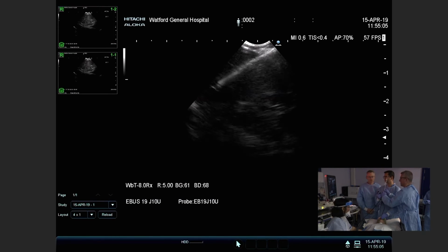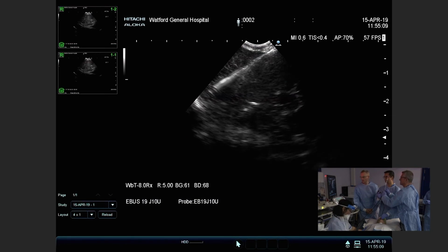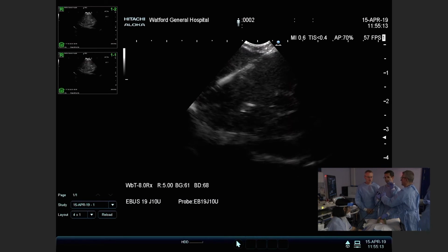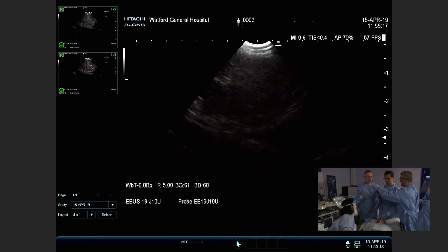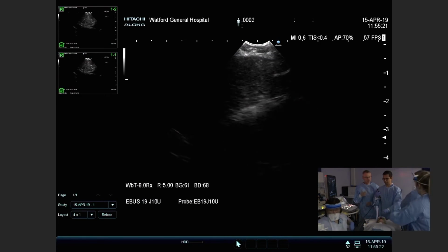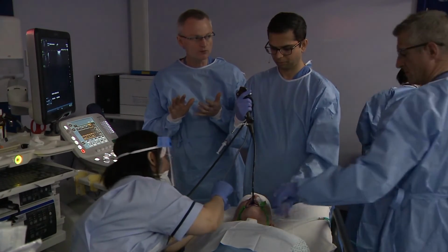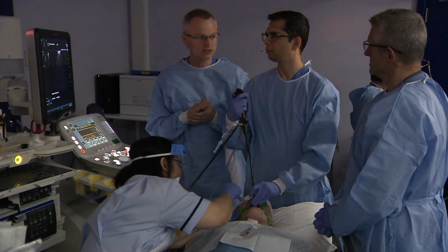And if you don't have rapid on-site evaluation, you just have to guess. You're working blind and hope for the best. Yeah, I totally agree. I think there are so many benefits to ROSE. The first is having immediate feedback, which for me, as a photographer, I look at the LCD screen on the back of the camera, and I know immediately if I have the shot or not, and then I keep going until I get that shot.